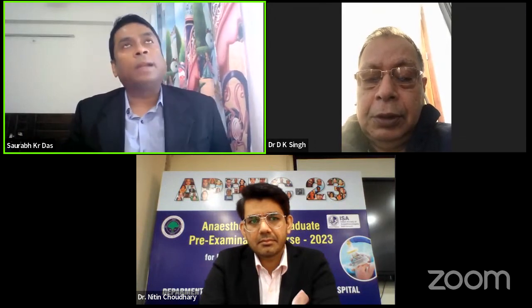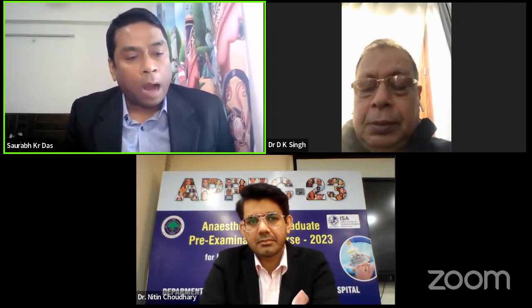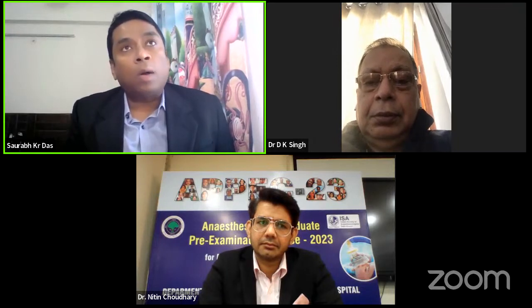But we have some relevance for the T-piece, particularly in patients who have heart failure, because of the pressure support we use for the SBT. Also, if you reduce it, they may fail. So it is important to try a T-piece trial in some particular patients. There is no hard and fast rule for how long, but we keep the patient on the T-piece for at least 2 to 4 hours. If the patient can tolerate the T-piece for 2 to 4 hours, we extubate the patient.